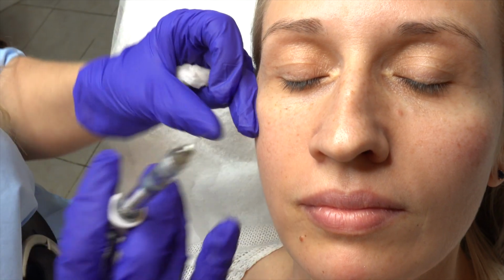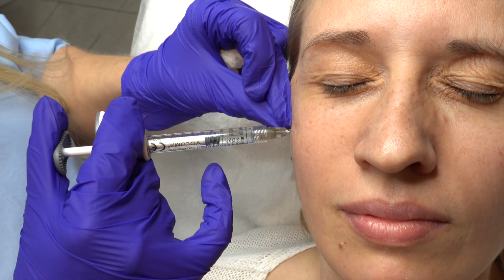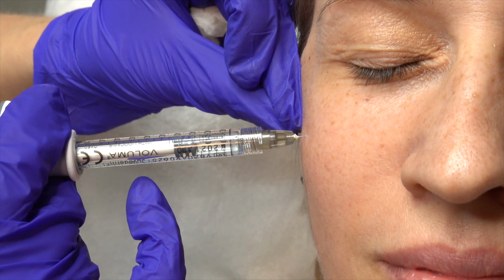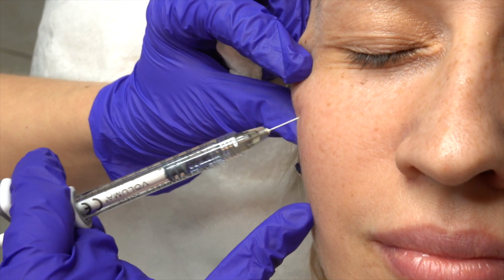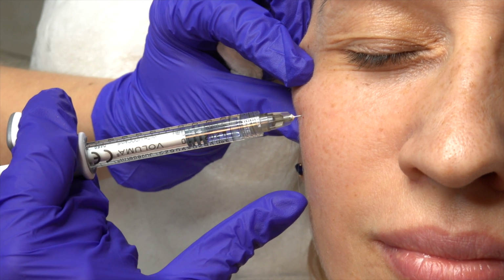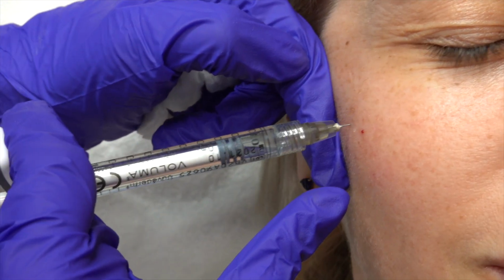And I'm injecting right here. To improve this beautiful definition, to create this beautiful definition. The same 0.1, 0.1 and 0.1.